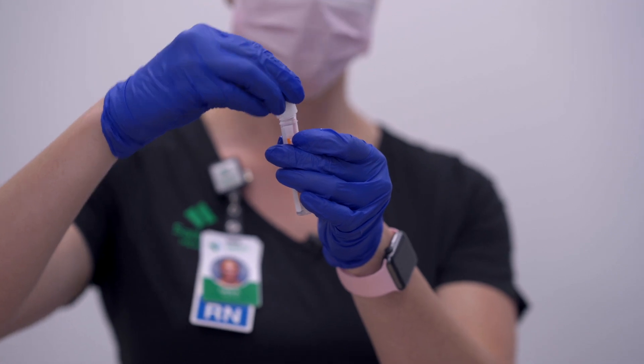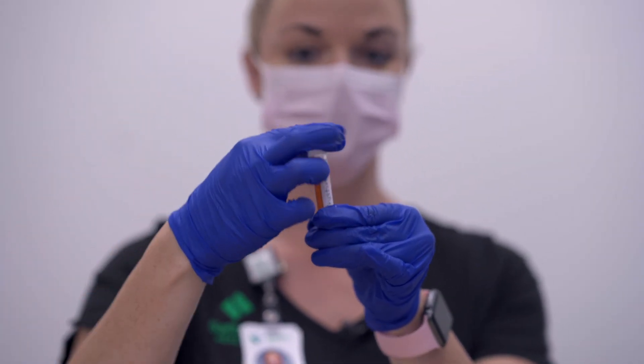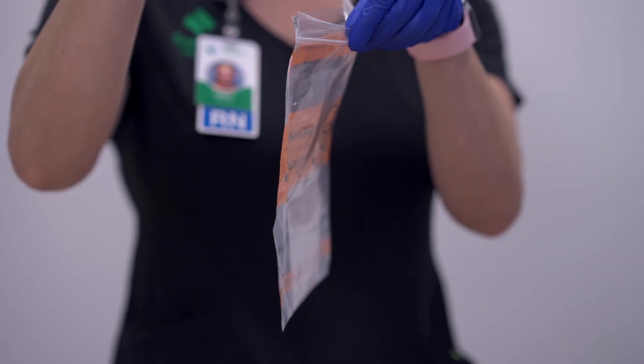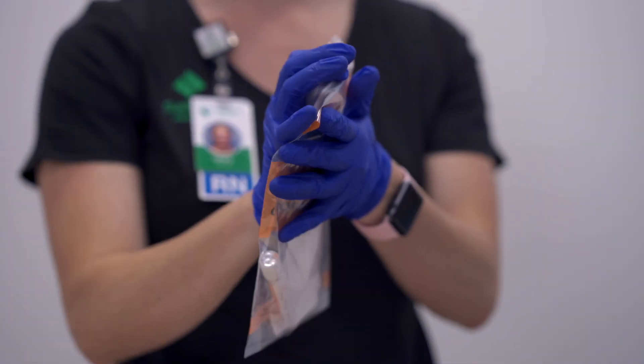Place the top onto your medium tube and make sure it's nice and tight. Place the tube into the lab biohazard bag — this is how it will be shipped back to the lab.